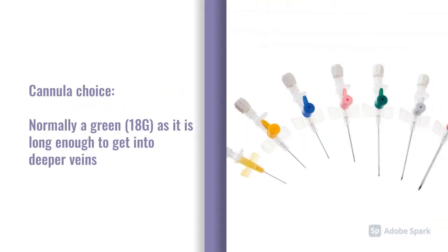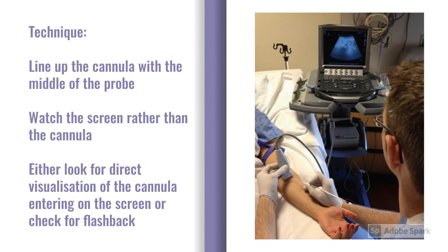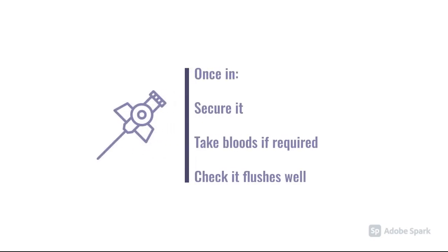Generally we'll be using a decent-sized cannula unless the vein is very superficial. A green cannula is recommended for most of these patients — particularly if they're very edematous or the vein is very deep — as a pink or blue is unlikely to reach. Line up the cannula with the probe and keep an eye on the screen as you pass through soft tissue. You can directly observe the cannula entering the vessel, or check for flashback as with normal cannulation technique. Once in, secure the cannula, take any bloods required, and make sure it flushes appropriately — if it doesn't flush, you'll need to find an alternative vein.